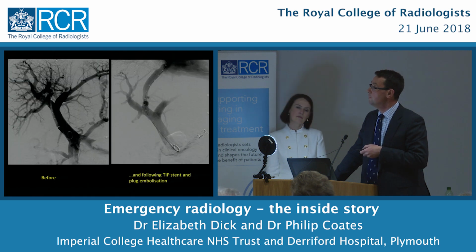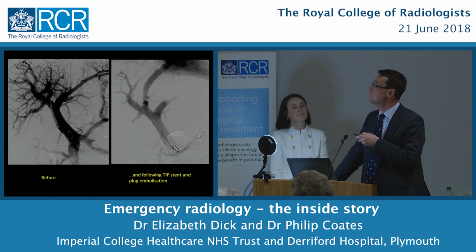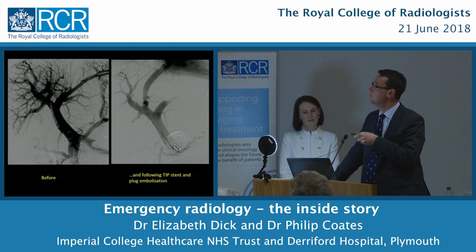So that's the before and after. In fact, that's having just gained access. And afterwards, this blood is no longer pooling here. It's travelling beautifully through the stent graft towards the right side of the heart up here.